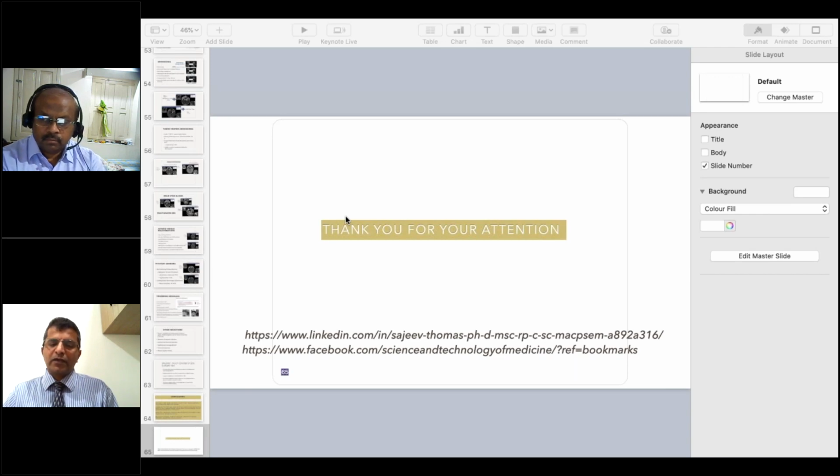In this case, Gamma Knife has multiple sources and multiple non-coplanar beam geometries are possible. Even one shot in Gamma Knife has 192 multiplied by 5 beam combinations. So it gives the results of multiple arcs in a single shot, I mean a single isocenter. That makes a huge difference between Gamma Knife and CyberKnife in the case of intracranial lesions.